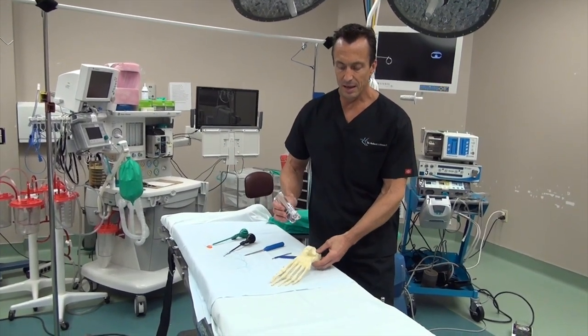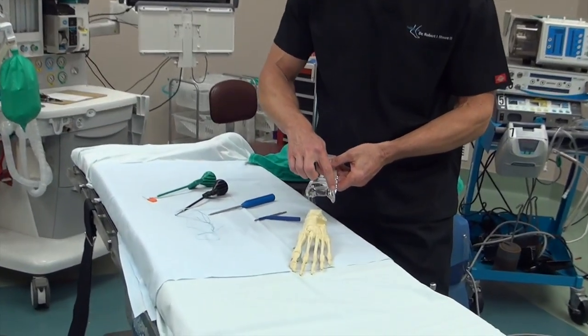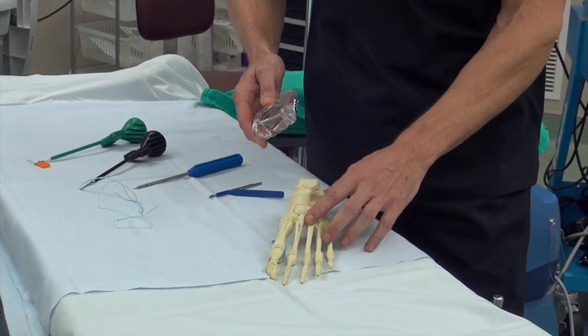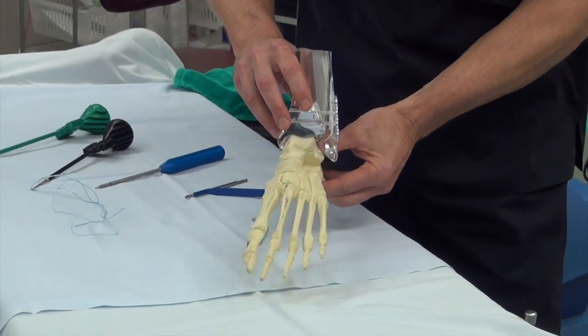Briefly, the ankle joint has three bones: the tibia, the fibula — here in this clear material — and the talus, which sits on top of the foot. The ankle joint goes up and down.